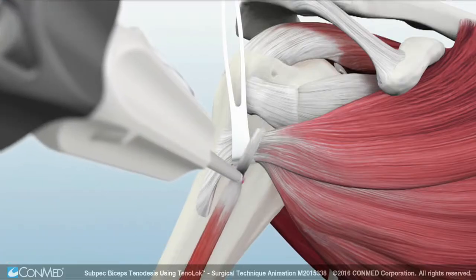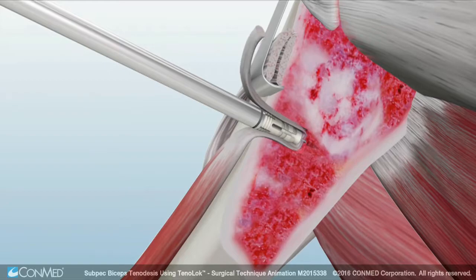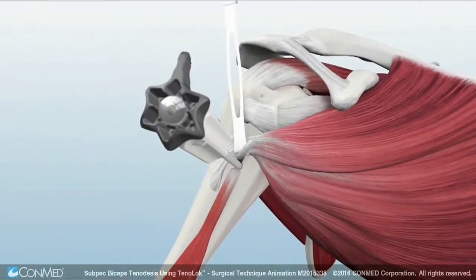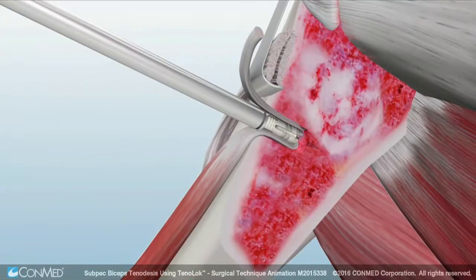Insert the implant while maintaining the same angle of approach used during drilling. Then deliver the implant and tendon construct into the socket with light malleting until the laser line is flush with the humeral cortex. While holding the delivery handle firmly, turn the knob clockwise to deploy the Tenoloc anchor. An audible pop sound signals the implant has fully deployed.